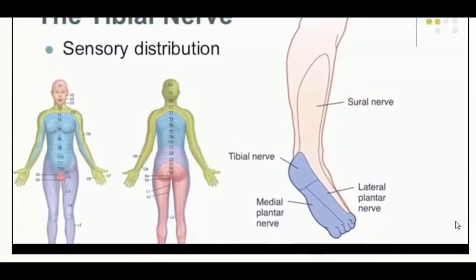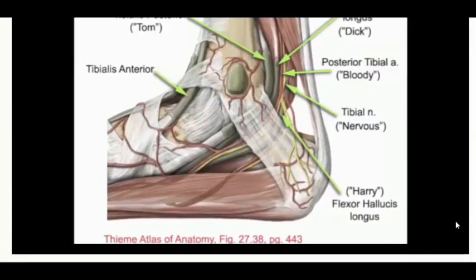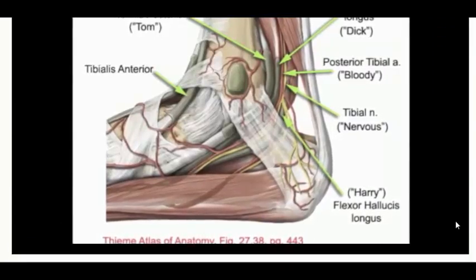Success with the tibial nerve block begins with a fine understanding of the anatomical relationships in the tarsal tunnel. Recall the medical school mnemonic Tom, Dick, and Very Nervous Harry that represent the various tendons and neurovascular structures of the tunnel, going from anterior to posterior. A good practical rule of thumb is to simply expect the posterior tibial nerve to lie posterior to the vessels.